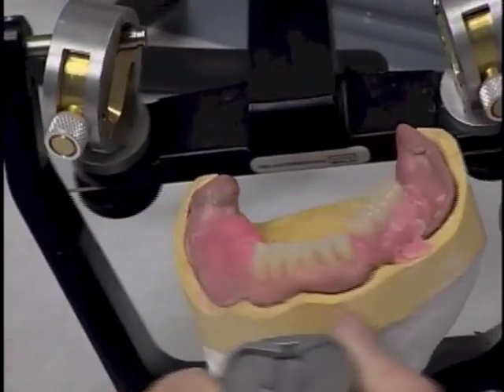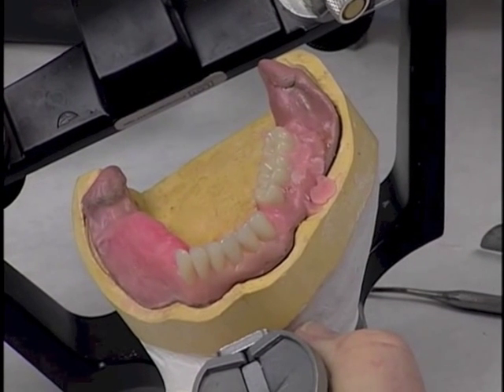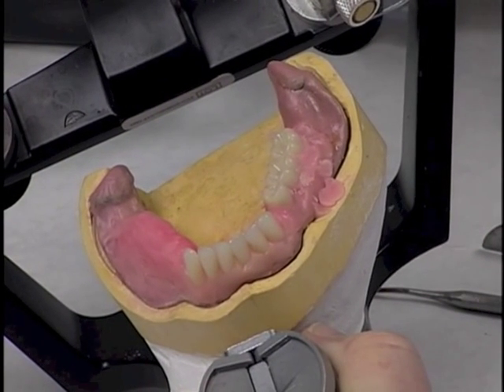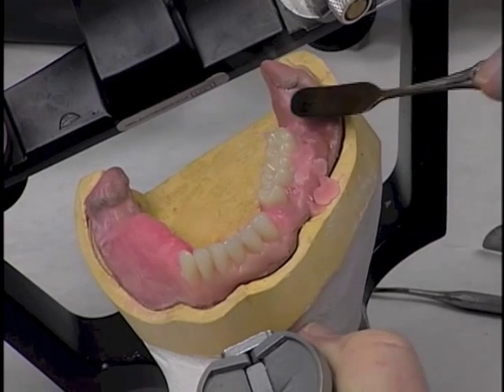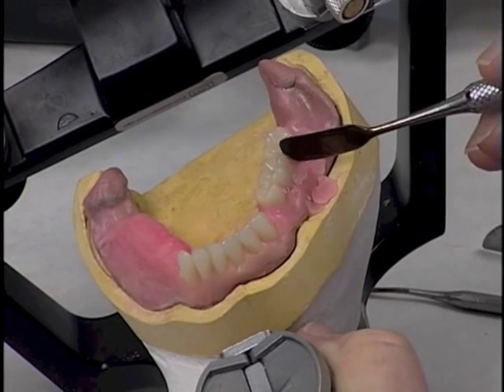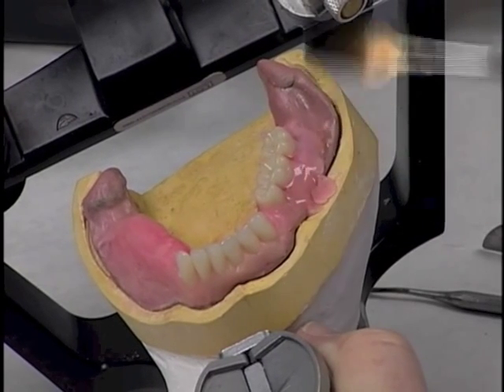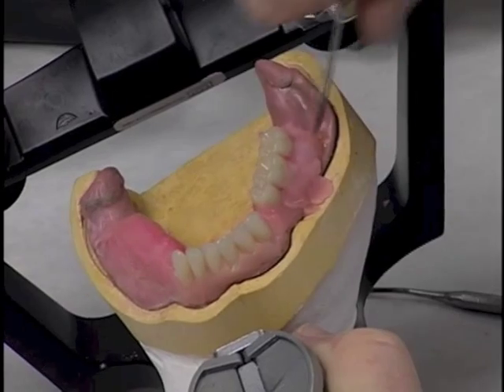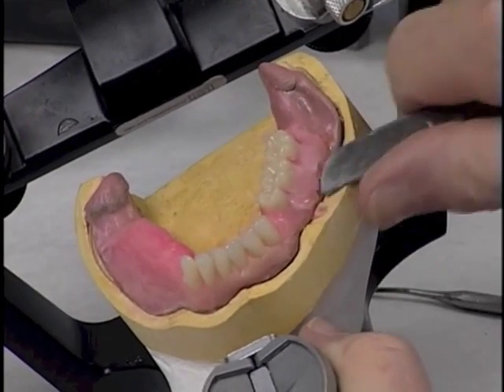So let's stabilize those teeth now. We'll do that by just melting the wax around them and letting that wax stabilize the teeth. We'll get rid of the extra wax that's there, just to keep it neat.